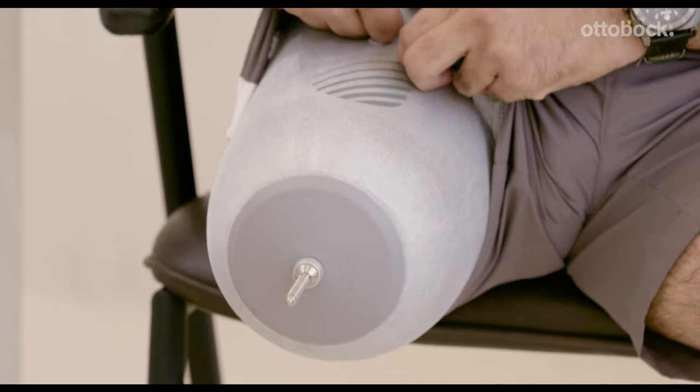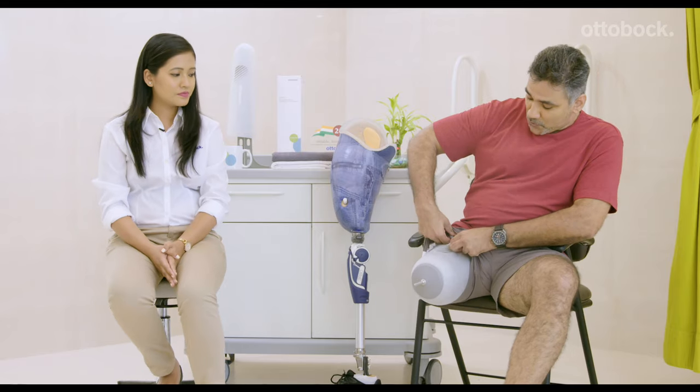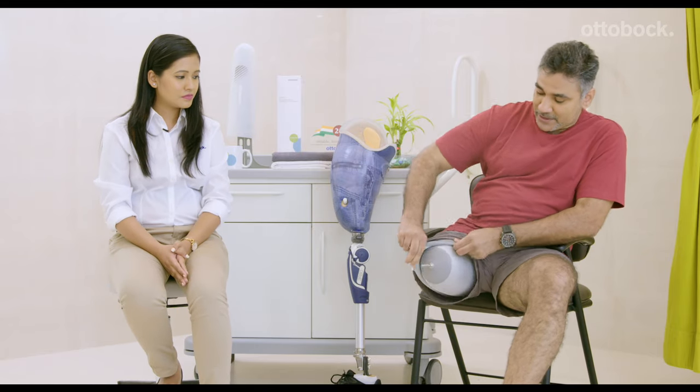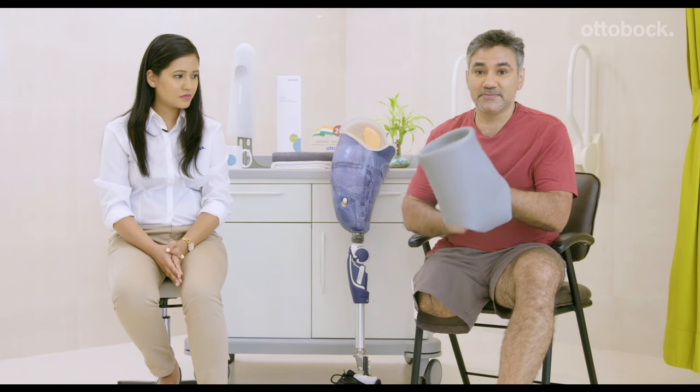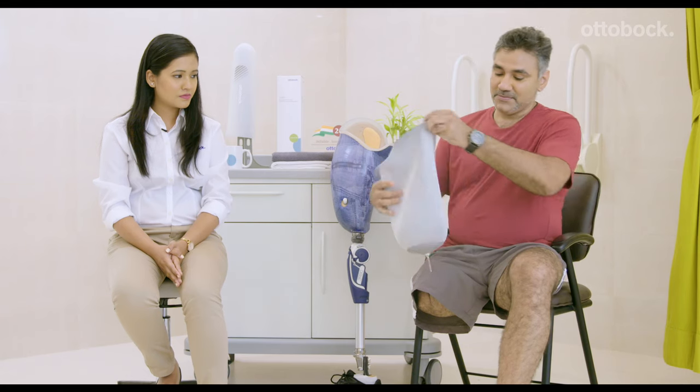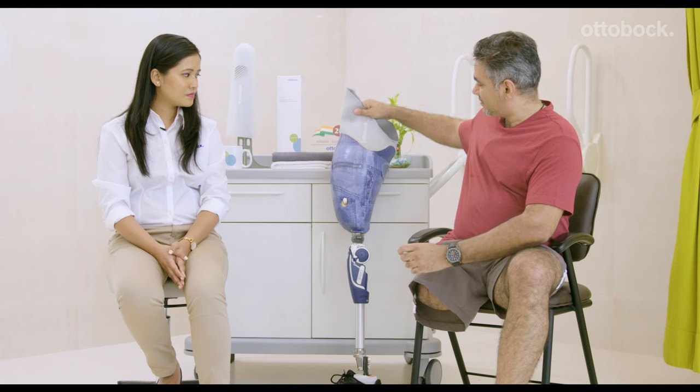Taking off your liner is pretty straightforward — all you have to do is roll the liner to the outside all the way out. A little tip from my experience: often you find it difficult to put on your trousers once you've done the prosthesis. What you could do is wear your trousers over the prosthesis and then slide your residual limb into the socket.